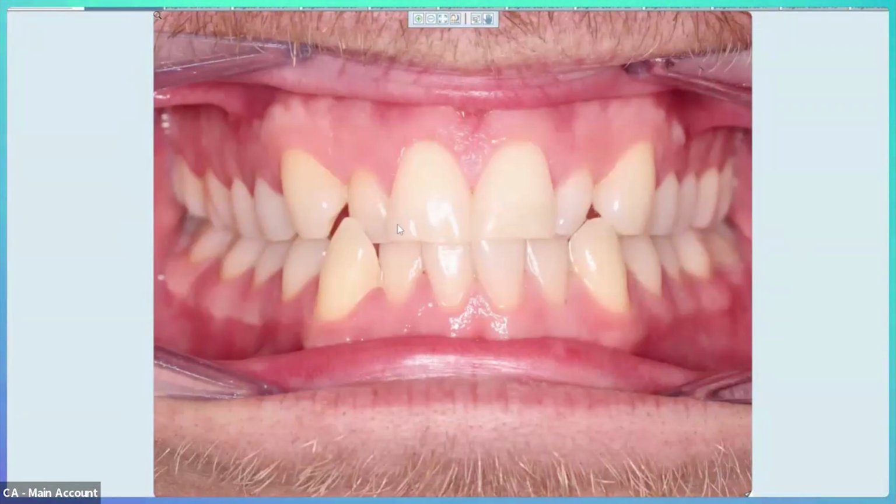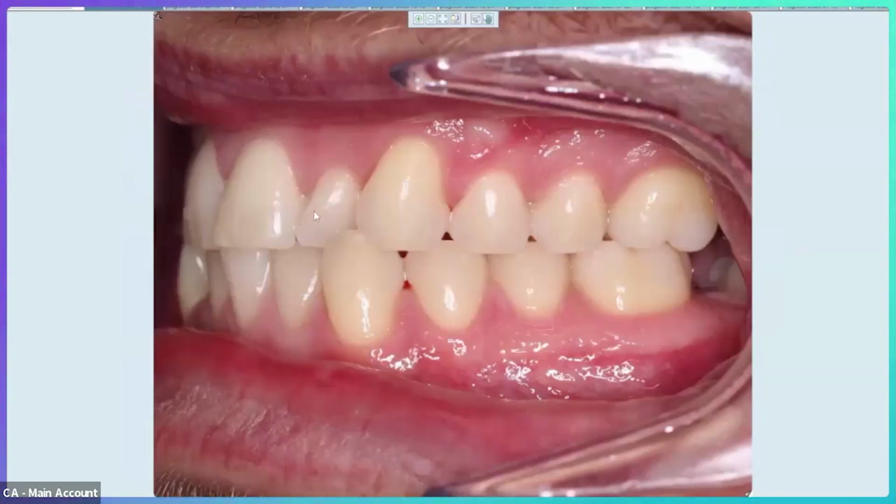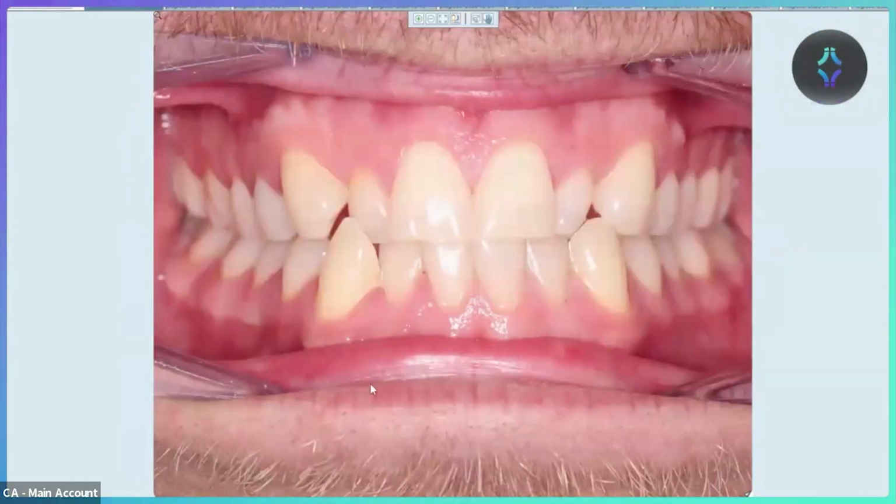Instead, the lid and the box are almost the same size. And so think about when you take a Tupperware container and you try to put a lid on that's too small and you force it on and it pops on in the back, great, but then in the front, it pops off. And so that's exactly what's happening to your teeth right now.